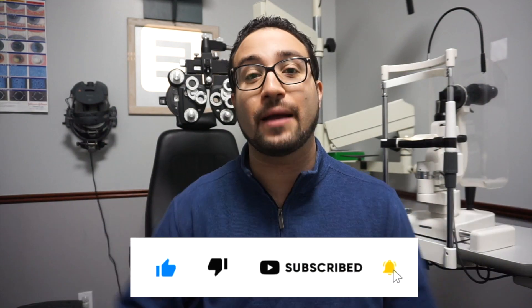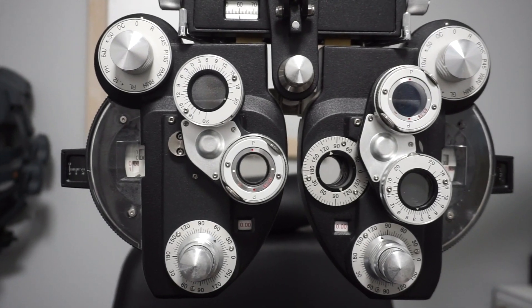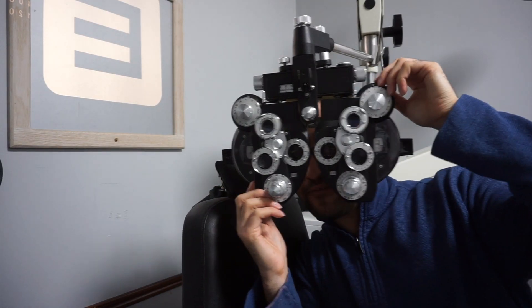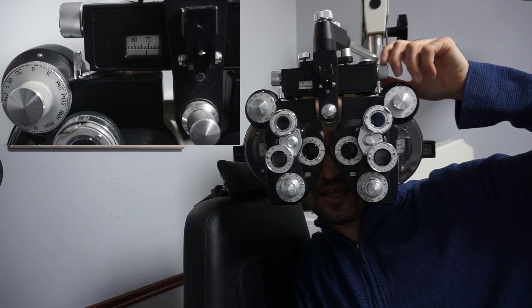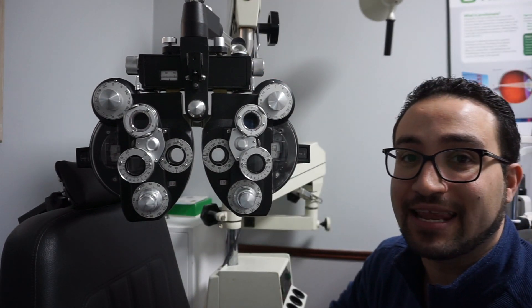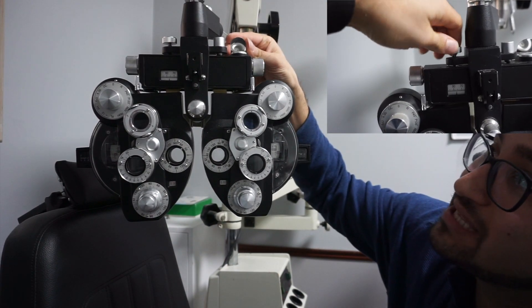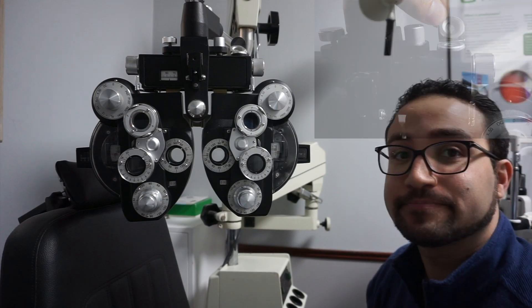This machine right here is called the phoropter. When we first put a patient behind the phoropter, what we have to adjust is the distance between their pupils — that's done with this little knob right up here. The second step is making sure the machine is in line using this knob right here and this indicator to let you know when it's perfectly centered and straight.